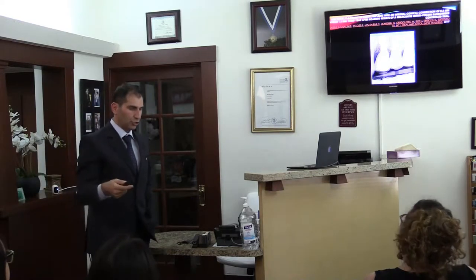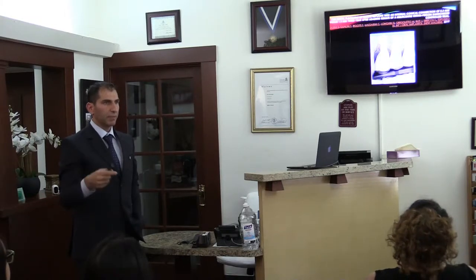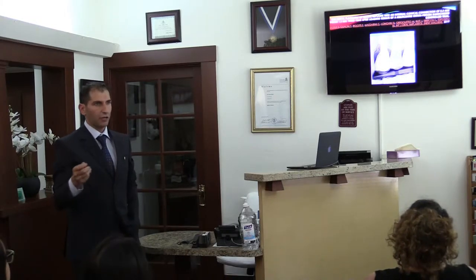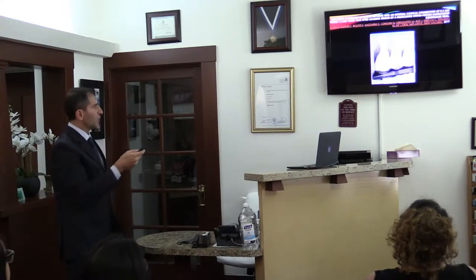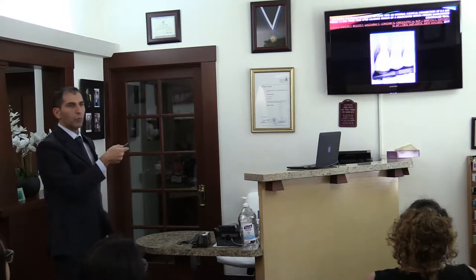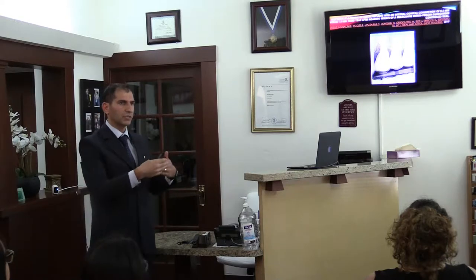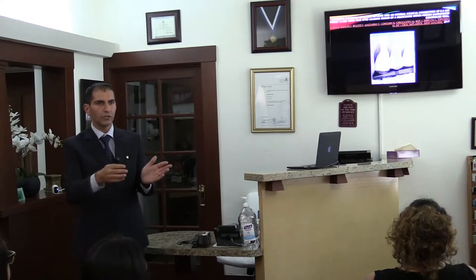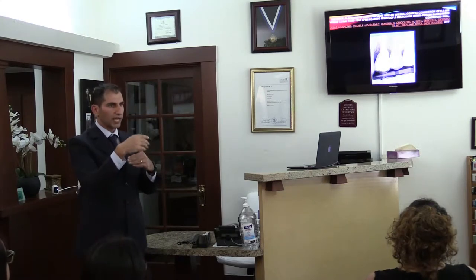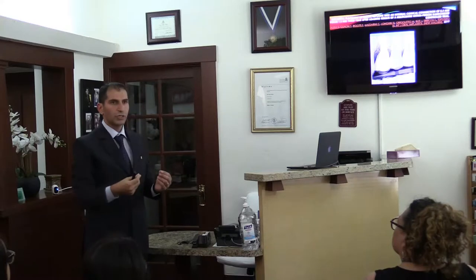When I start to do immediate implant placement, extraction and immediate implant placement, which I'm a big fan of, there is a reason why. But I'm going to focus on this concept: how are we going to place the implant three-dimensionally? I know you know facially you want enough thickness of bone, and enough thickness toward the lingual and interproximal, so you don't get close to the other teeth. But I'm talking vertically, because I think that's the missing part we struggle to understand.